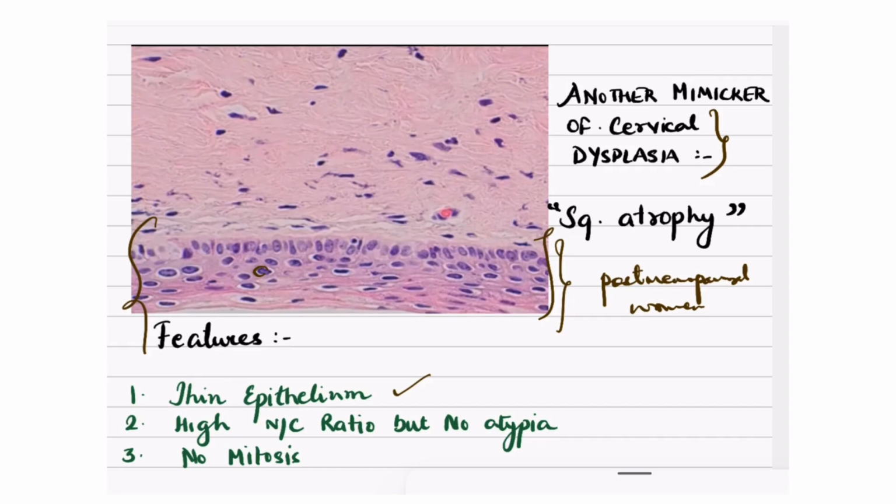Look at the cells individually, like cytology. You will find cells are very friendly, nice, very subtle. Not screaming at all, look at me. They're not asking for attention at all.